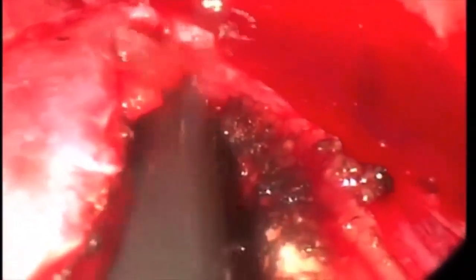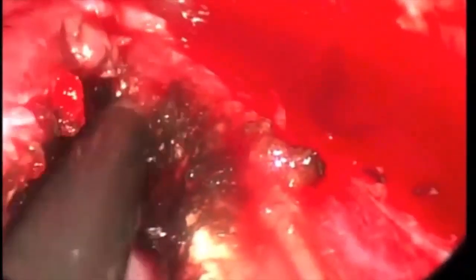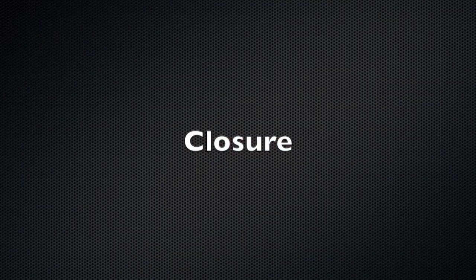Inspection of the surgical field is done, showing full release of the bones, parietal from frontal bone as shown here. Closure is done with absorbable monocryl galeal sutures and steri strips for the skin.